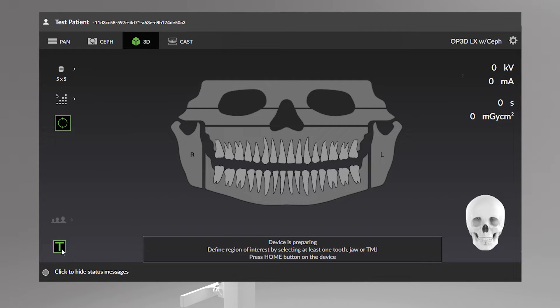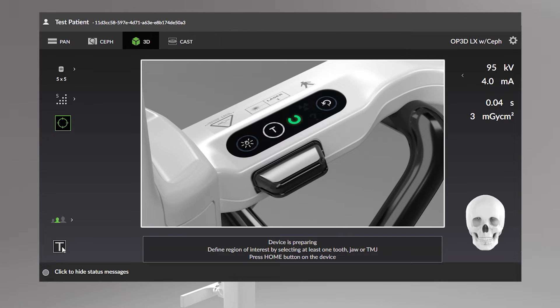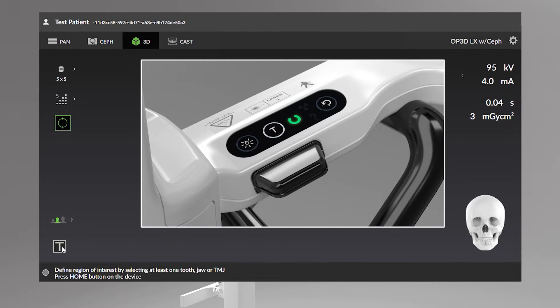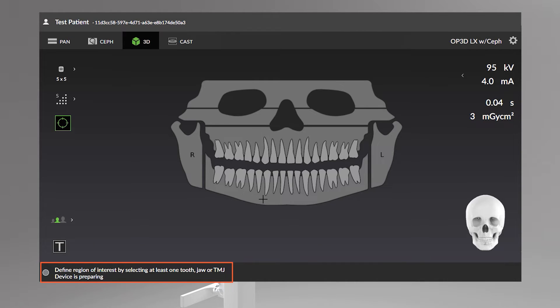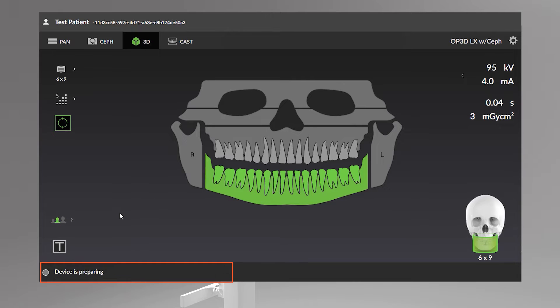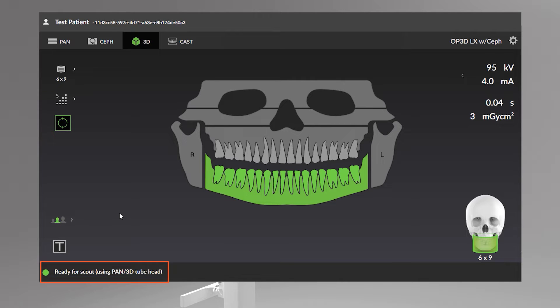Test mode disables device radiation production and can be used to demonstrate the device's movements. You can also use the unit control panel to enable and disable test mode. The device status indicator message bar displays the device status with a color-coded indicator. A gray indicator means the device is not ready, while a green indicator lets you know the device is ready for imaging.